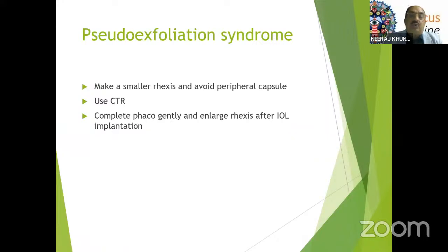Now coming to pseudoexfoliation syndrome. Here make a smaller rhexis and avoid the peripheral capsule. Use the CTR, complete phaco gently, and then enlarge the rhexis if needed after IOL implantation.